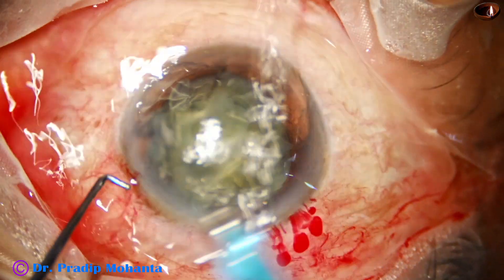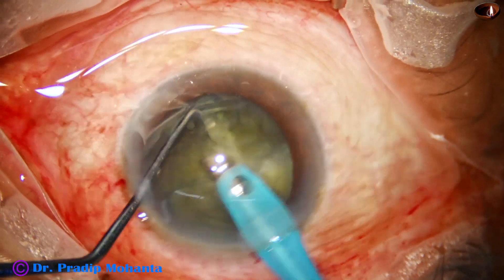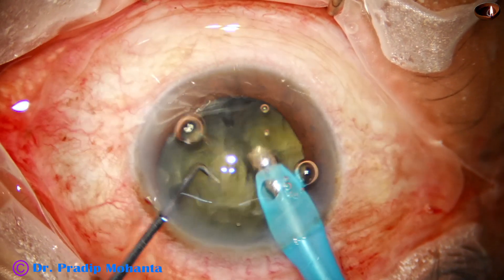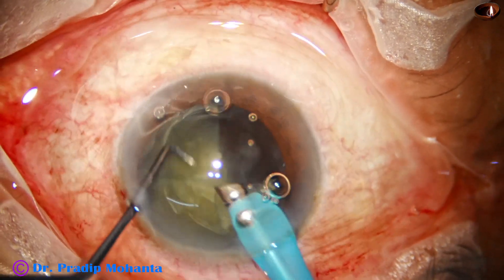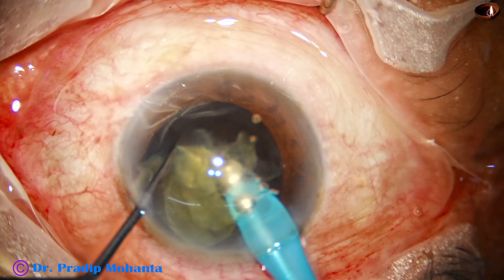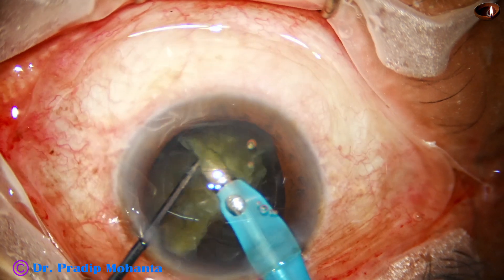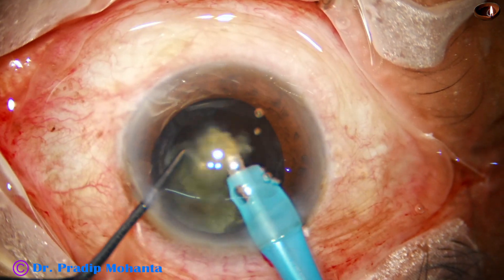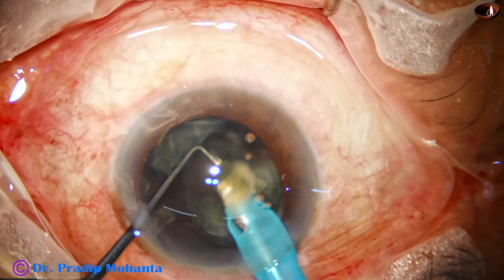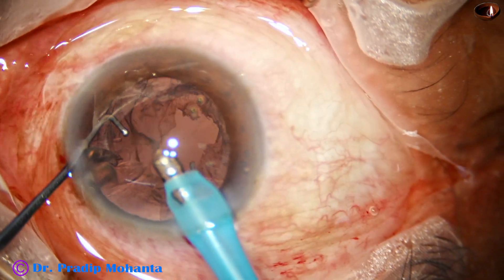Here goes the handpiece now. Let's see how beautifully we can emulsify the pieces. Just get at the apex of the piece and it comes so easily. You are always at the center of the anterior chamber in the central 3-millimeter safe zone. You just divide the hemi-nucleus going along the equator and finish the nucleus in such a short time.